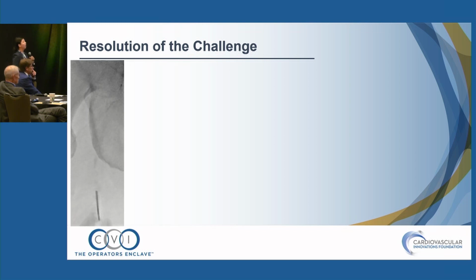Step-by-step, meaning with laser? With laser, yes, step-by-step with laser, for 10 seconds? Yeah. Step-by-step is essentially you have a laser up front to soften the rock that we're trying to break through. Softening it will allow you to penetrate the CTO cap from whichever direction you're trying.